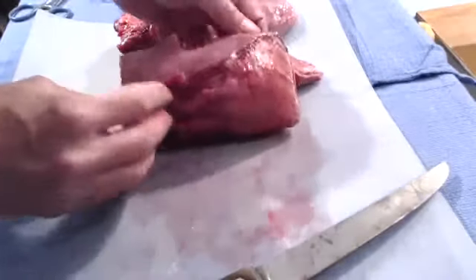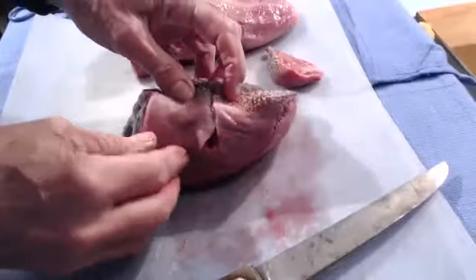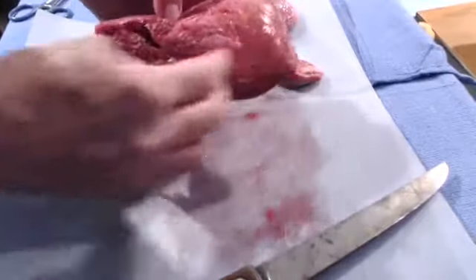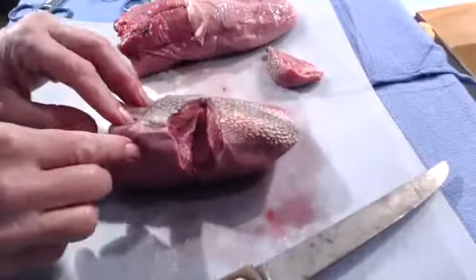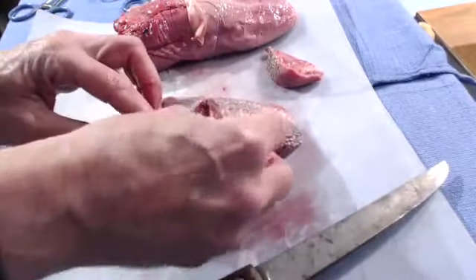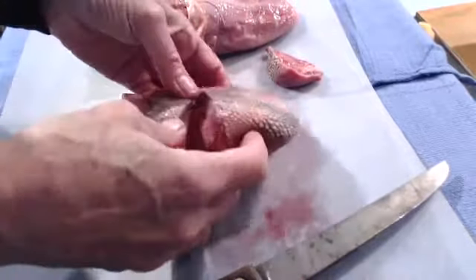The other thing, and I'm trying to decide if I need to do it for this one, I don't think I do, is sometimes this underneath section needs to be trimmed. It looks like somebody already trimmed this one so that it lays relatively flat. You can make the model have jagged edges if you like. I'm not going to do that on this model.